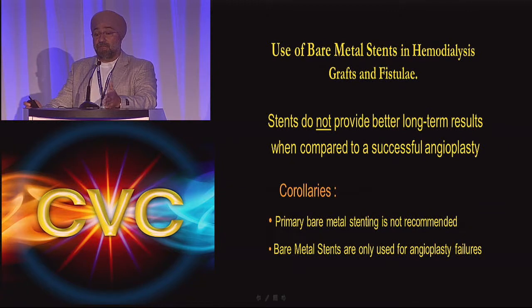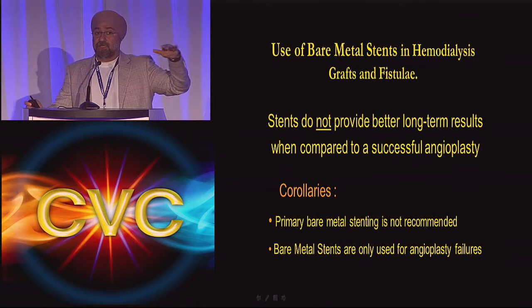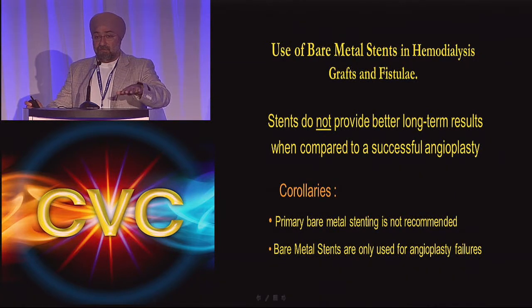Clinical evidence of success is when you have a thrill. If all the blood's zipping right by, you put your hand on the graft, you feel a thrill. If there's a pulse, it means there's some obstruction to the outflow. So after doing all the intervention, the flow looks good, you put your hand on the access, and there's a pulse, there has to be an obstruction in the circuit somewhere. Investigate that. And then we used to put the stent in, got a thrill, very good.